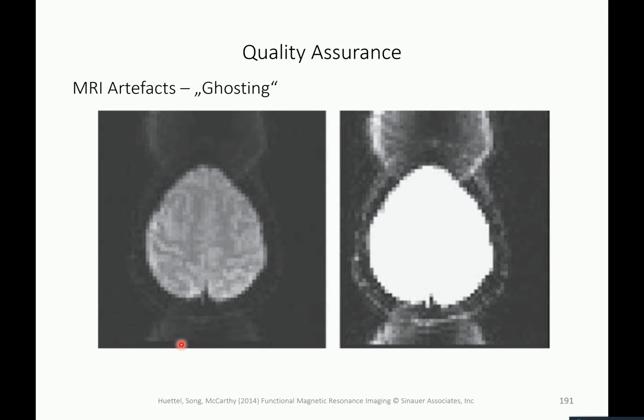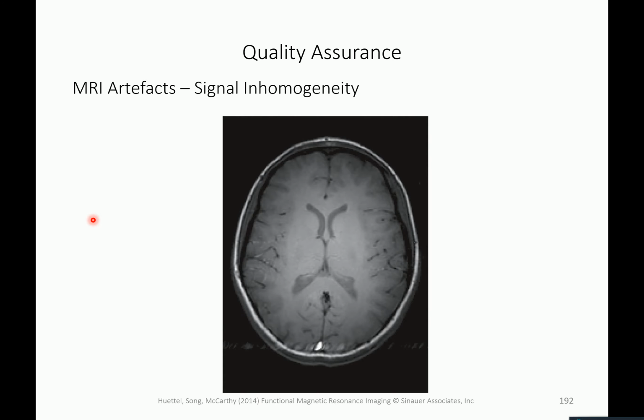One can actually understand the theory if one goes a little bit into the Fourier and discrete Fourier transforms and the questions of aliasing. So this is where these things come from. Usually, however, it is not so much that something is going wrong with the Fourier transform, but with the signal acquisition itself, and then the real and imaginary components of the raw data are wrong, and then you get these kind of things. It's not what we discuss in detail here, it's just another artifact that you're supposed to be able to see. So, ghosting.